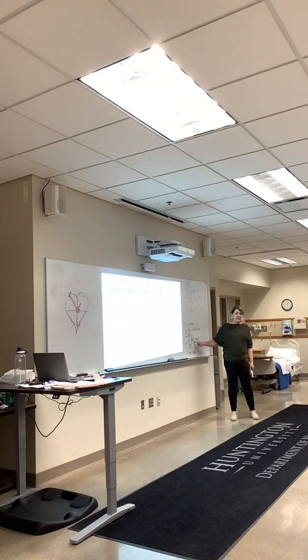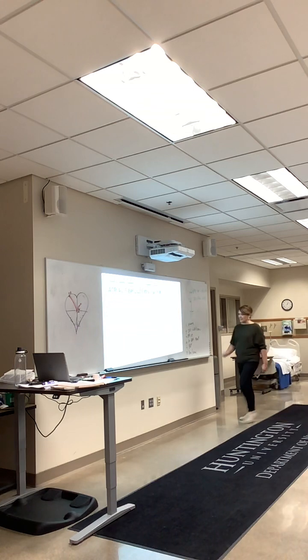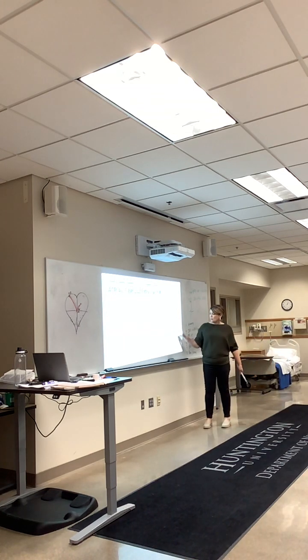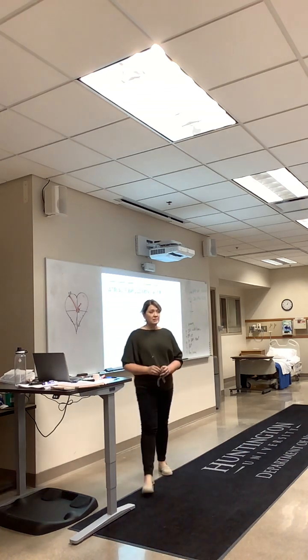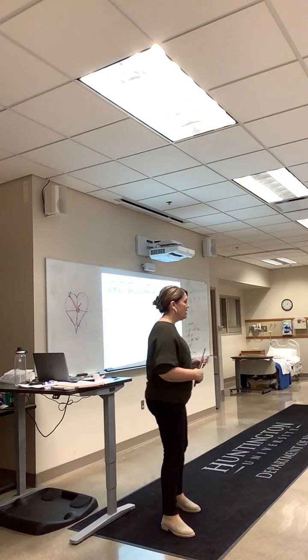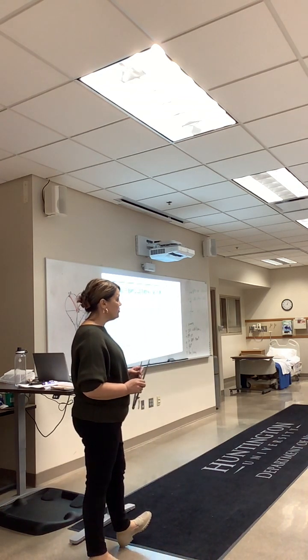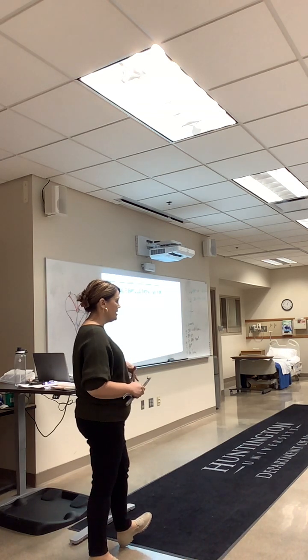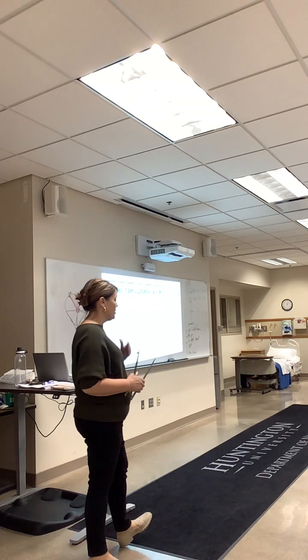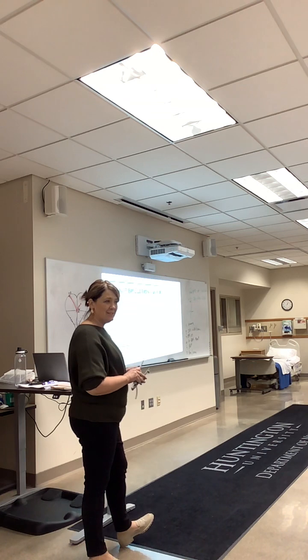Do I have a P wave for every QRS? No. You have more P waves than QRS. It's not equal. Okay, so write that down there. And then what's my rate? Right here, this one's at 100, and it's irregular. When people have AFib, if it's uncontrolled, it tends to be over 100. If it's controlled, it'll be less than 100. But most AFib patients, when they first go into AFib, it's usually well over 100. Just keep that in mind.